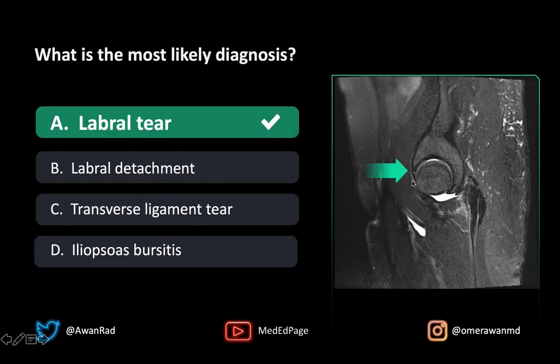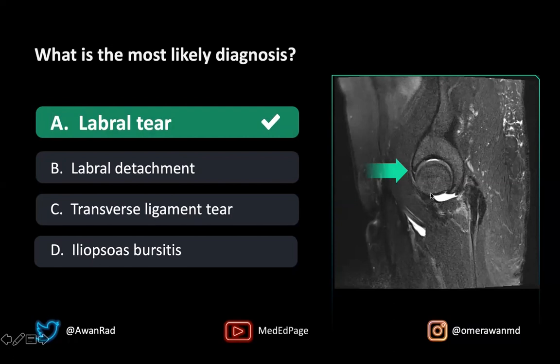The transverse ligament runs from the anterior labrum to the posterior labrum. Remember, the labrum is not a 360-degree structure as it is in the shoulder — it's 270 degrees. The transverse ligament is that last 90 degrees that bridges the anterior to the posterior labrum, but it's certainly not torn in this case. And this is not iliopsoas bursitis — that's just iatrogenic fluid or contrast from the actual injection.